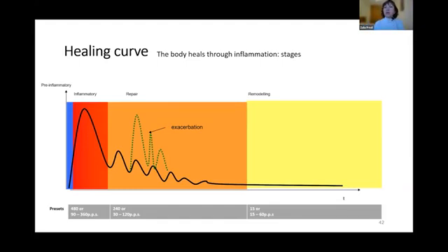You will see there is an opportunity to change the way your device shows the interface into sport mode. And then you could see that automatically every assigned frequency is assigned to the process. So you could use this way to treat your patients, particularly if you understand the healing curve, and then you would be able to navigate and set your device this way.